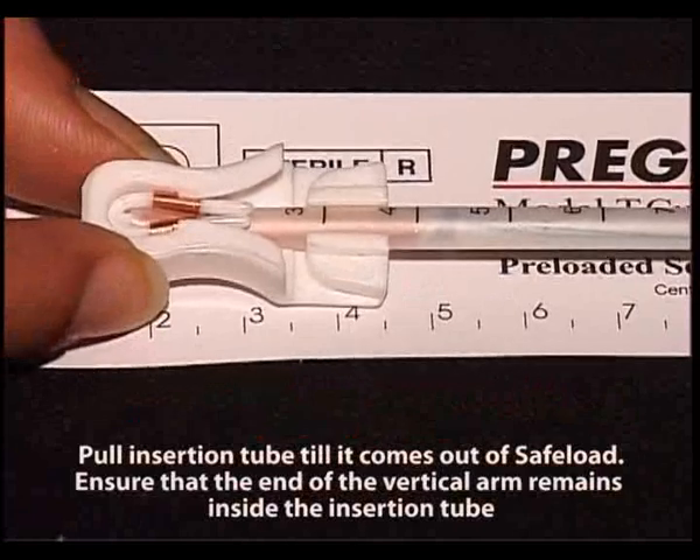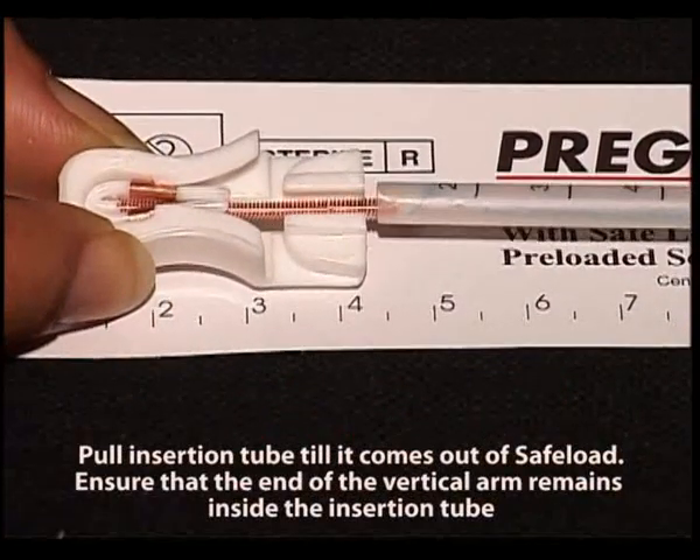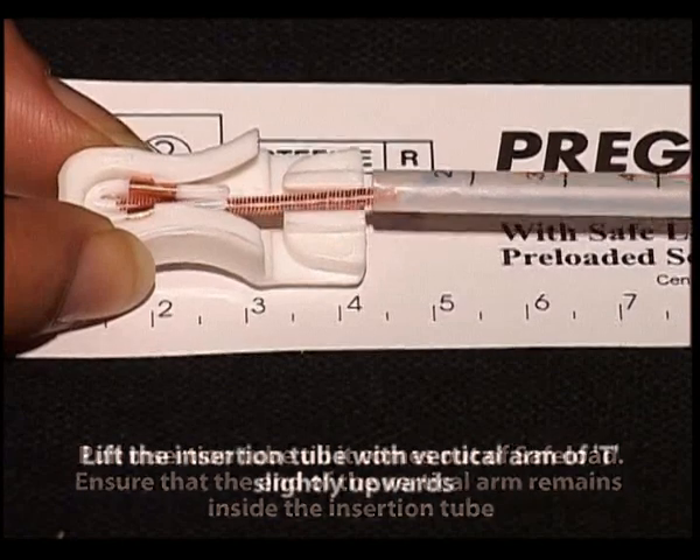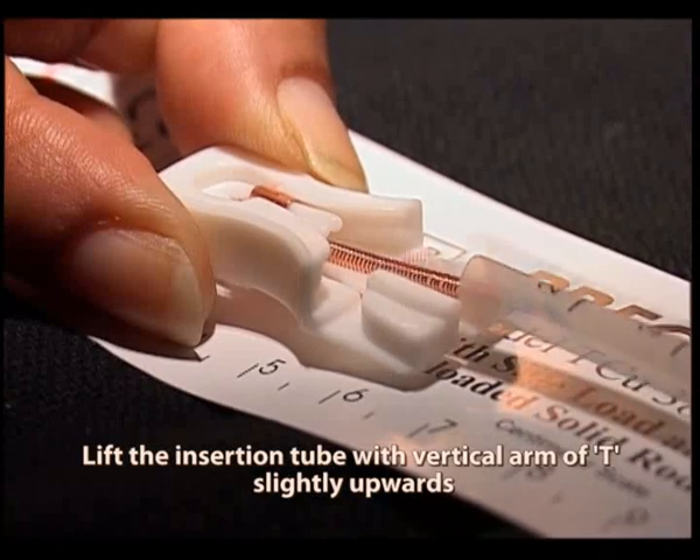Pull the insertion tube till it comes out of the safe load. Ensure that the end of the vertical arm remains inside the insertion tube. Lift the insertion tube with the vertical arm of T slightly upwards.